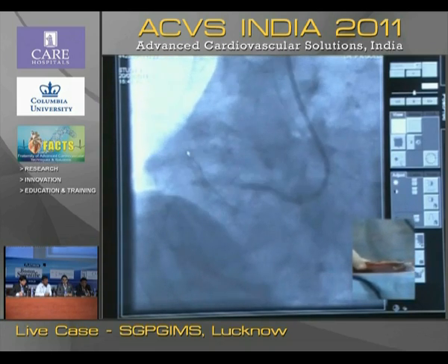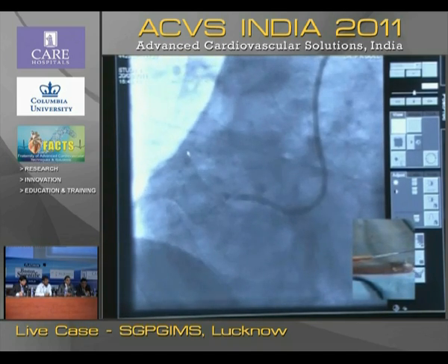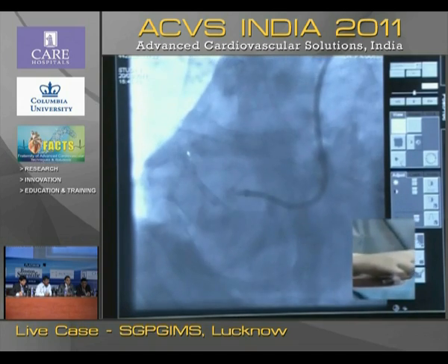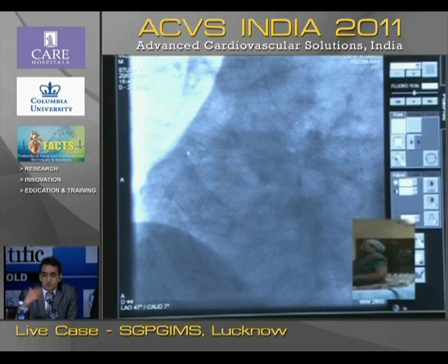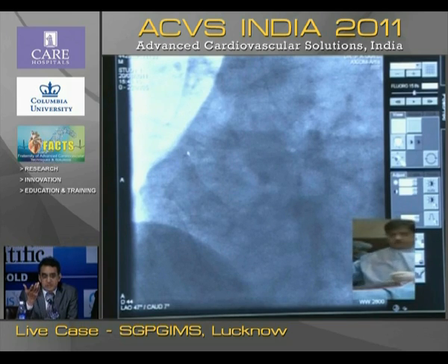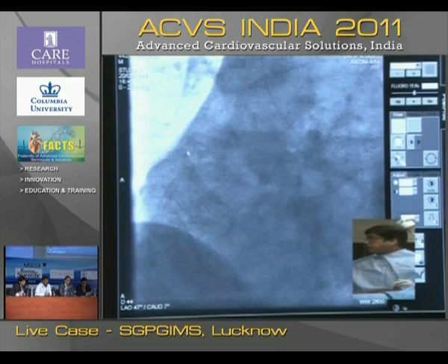Pressure. Test. You're pretty deep-throated. Yes, a side hole catheter is needed, because without side holes the catheter will always land like this. It's difficult to place it. See, if you pull it, it cannot be adjusted. So that's why the suggestion that there should be side holes is quite a reasonable thing. We will go deep into that. Most of the dissections which occur are with the Amplatz catheter.